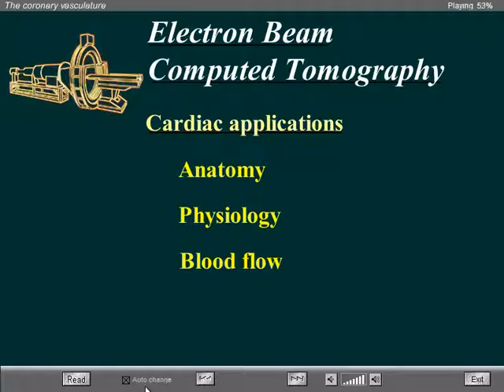And when we talk about the physiology of the heart, we refer to contractions of the heart muscle, the dynamic studies of the atrioventricular valve as well as of the aortic valve, the study of flow in the heart and in the coronary arteries, as well as myocardial perfusion and, in the postoperative heart, flow determinations at the level of the grafts.